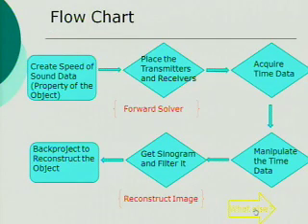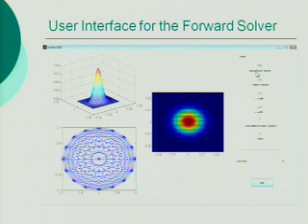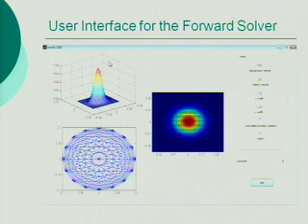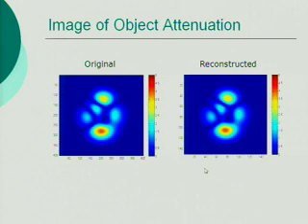I also made a user interface for the user to create the object. The user can specify different parameters like background velocity, transmitter-receiver numbers, and the shape of the object — in this case, a Gaussian distribution. This is the image of object attenuation. Instead of representing the object with speed of sound, you can also represent it with an attenuation factor. This shows my program works.